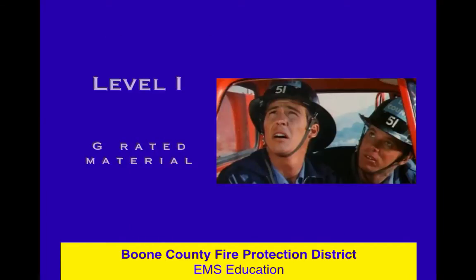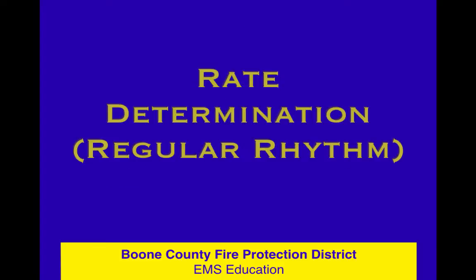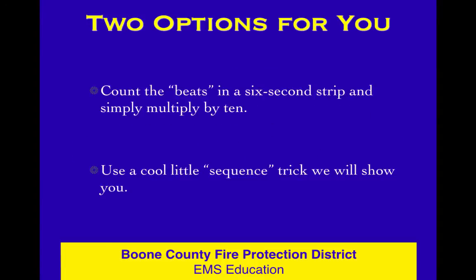Okay, next in our EKG course, still in level 1, continuing in the rate unit, we talked about paper and how a little box is 40 milliseconds. There's 5 little boxes in a big box, that's 200 milliseconds, and how the 6-second strip will help us determine rate. So let's get on to regular rhythm rate determination.